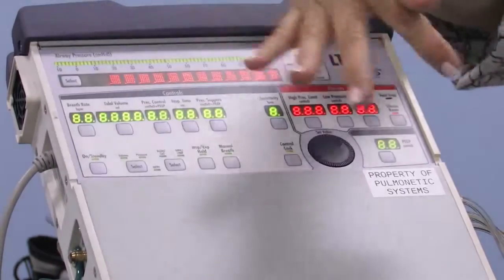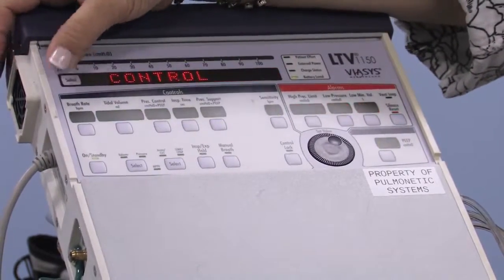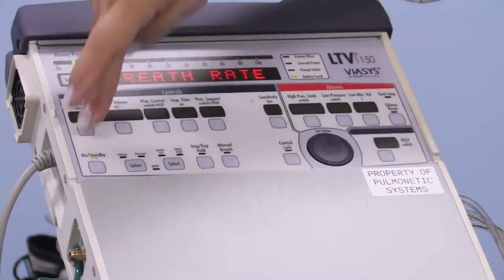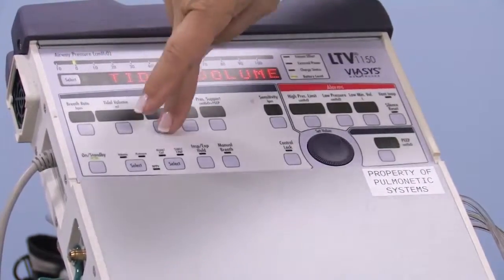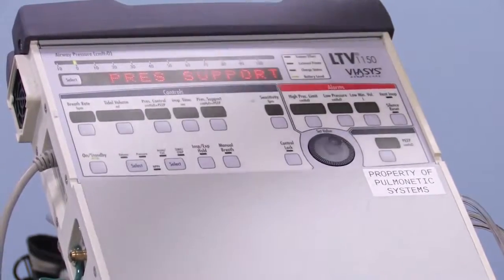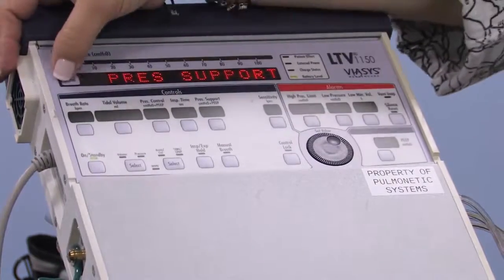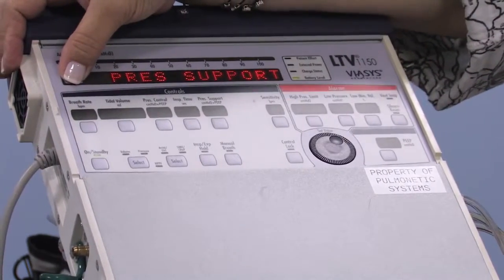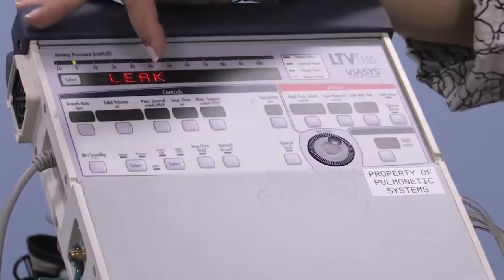We can see that all the lights are functioning. The third check is for the controls. If I want to, I can see that that's breath rate, and that's tidal volume, and that's pressure control, so that they're all coordinated properly. And the last one, but the most important one, the one that everyone is getting into this menu for, is the leak test.